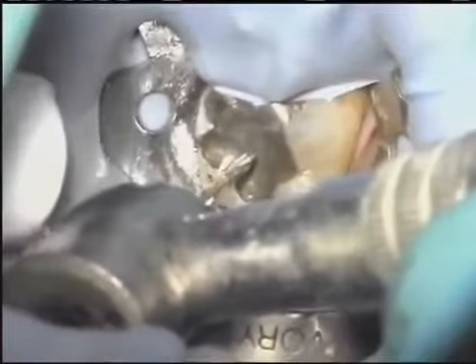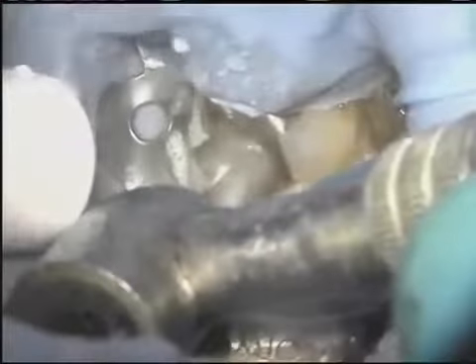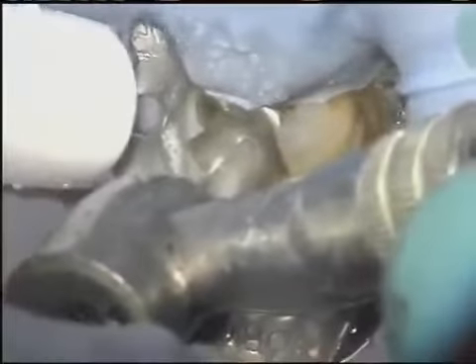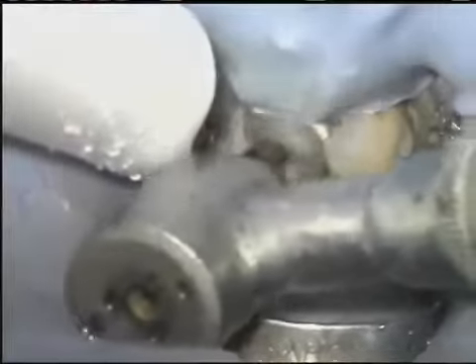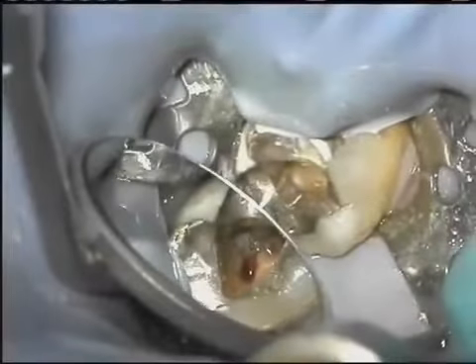With the ProTaper Universal system, as with any instrument system, a good outcome begins with good access. We've edited the procedure to focus on just the key points of the technique. In this clinical example of a lower molar, we'll be focusing on the mesiolingual canal. All of the other canals are prepared in the same manner.